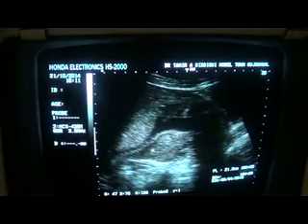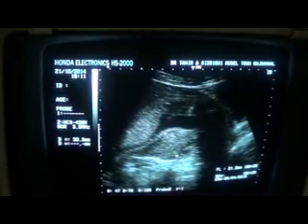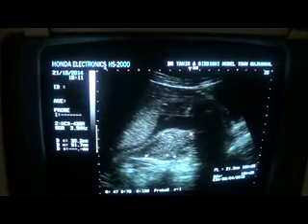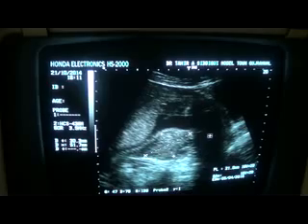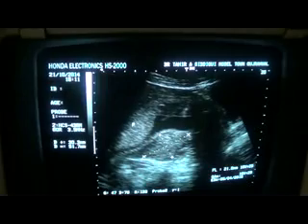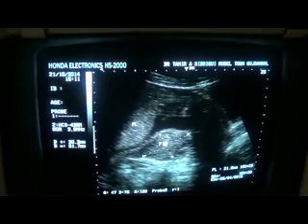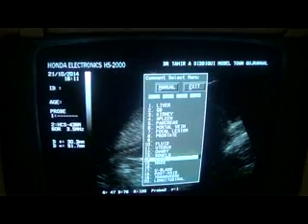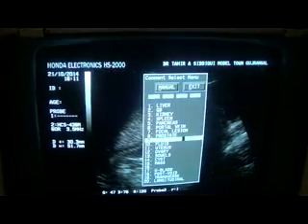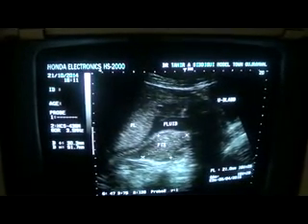This is a fibroid that relates to the posterior segment of the posterior wall of the uterus. And this area that you are seeing is the placenta. This is the placenta. This is the fibroid. And this is the urinary bladder, this area. But this is the fluid, that is the amniotic fluid. This area shows amniotic fluid.